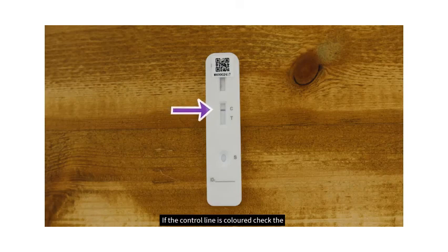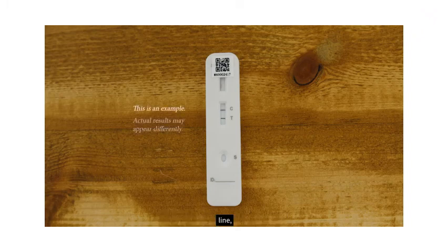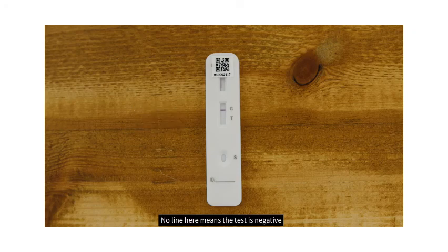If a control line is colored, check the result line of the device marked T. A line shown, even a very faint line, is indicative of a positive test result. No line here means the test is negative.